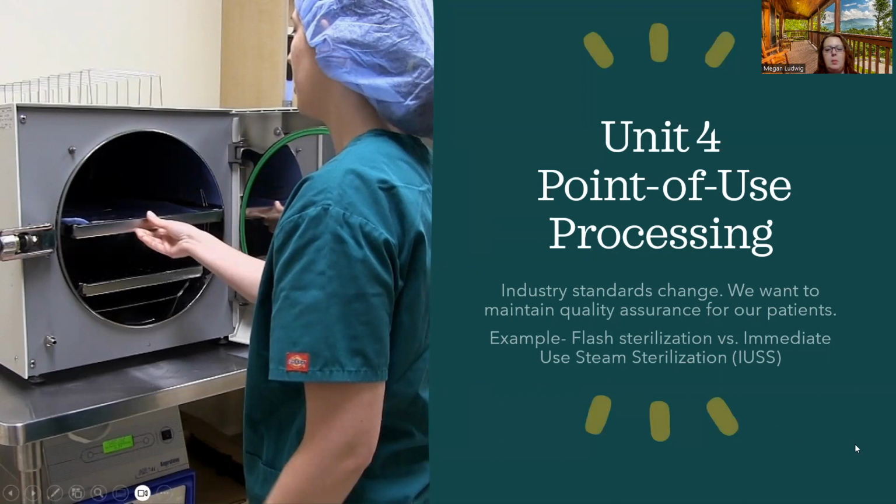So an example I put here is the difference between flash sterilization versus something called immediate use steam sterilization, or IUSS. Back in the day, when I first started, we would call it flash sterilization. It's something where maybe an instrument is dropped in surgery. Maybe that's the only one. The surgeon needs it right then. They can put it in what we would call a flash sterilizer that the load only runs for 3 to 4, maybe 10 minutes, depending on the item. And then they could have it back quicker.